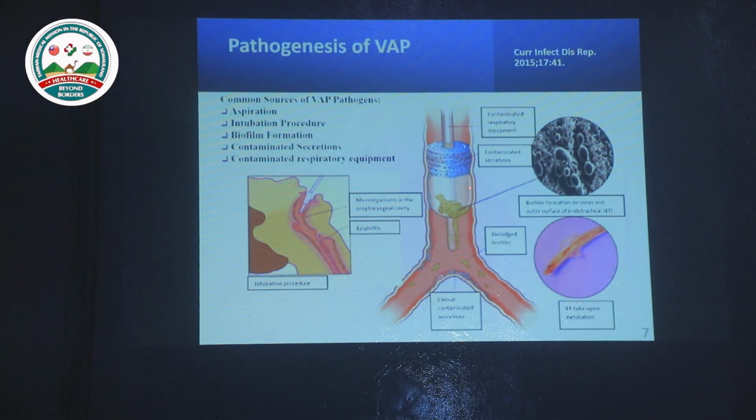Another thing is that some bacteria can form biofilm and coat the endotracheal tube, and the patient aspirates it, causing VAP. Another is the ventilator circuit, because we usually need to add humidification within the circuit, and this can cause condensed water, which sometimes has bacteria inside, for example Legionella. This bacteria can be inhaled by the patient by aerosol transmission. So this is another source of VAP.